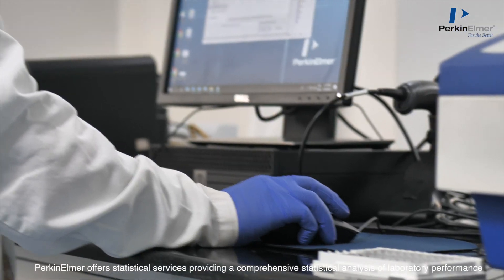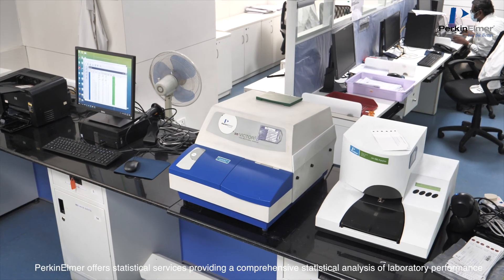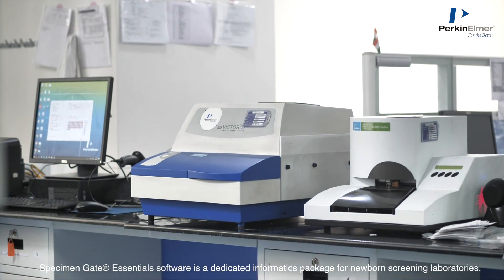PerkinElmer offers statistical services providing a comprehensive statistical analysis of laboratory performance. Specimen Gate Essential Software is a dedicated informatics package for newborn screening laboratories.